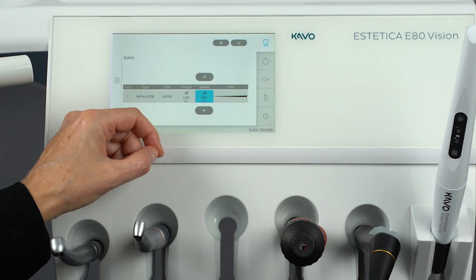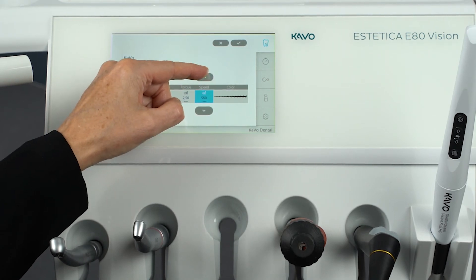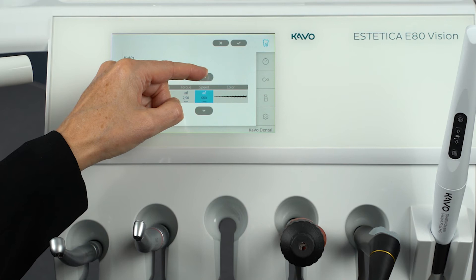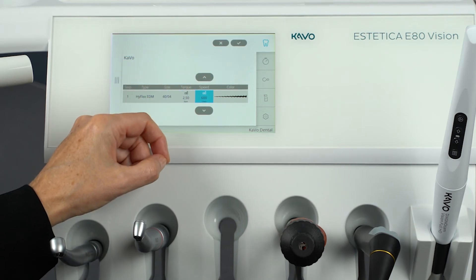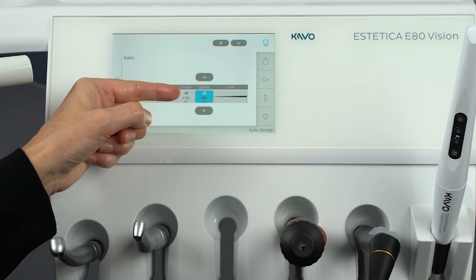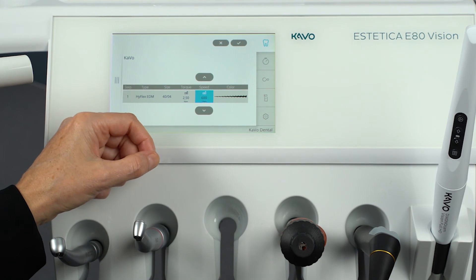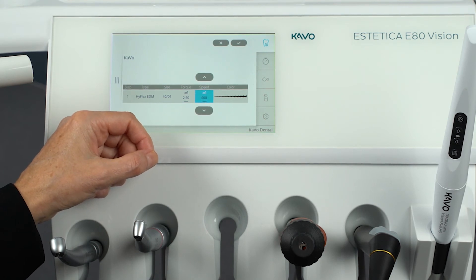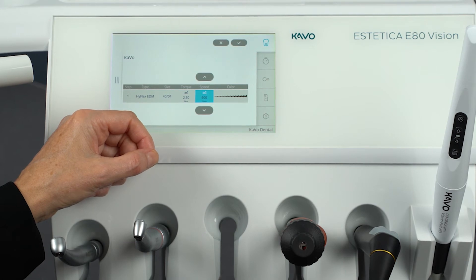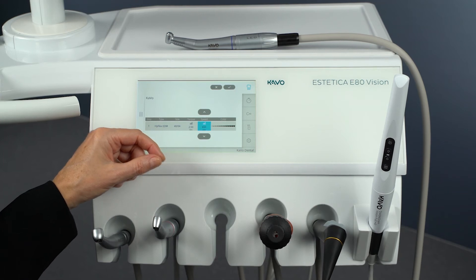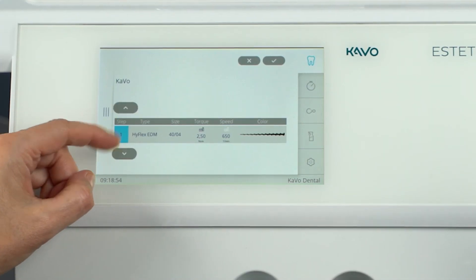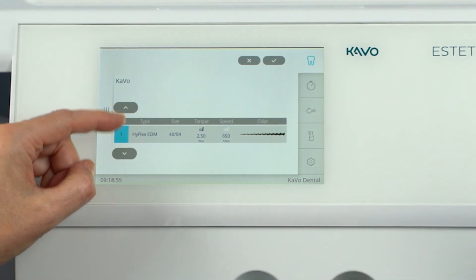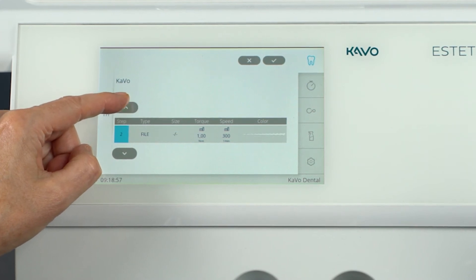The values for speed and torque of the files from the file database can also be changed here. The data recommended by the file manufacturer are marked with a gray factory symbol. The user-defined files are an exception to this — by selecting and customizing user-defined files, you can insert a file system into a sequence that is not stored in the database.